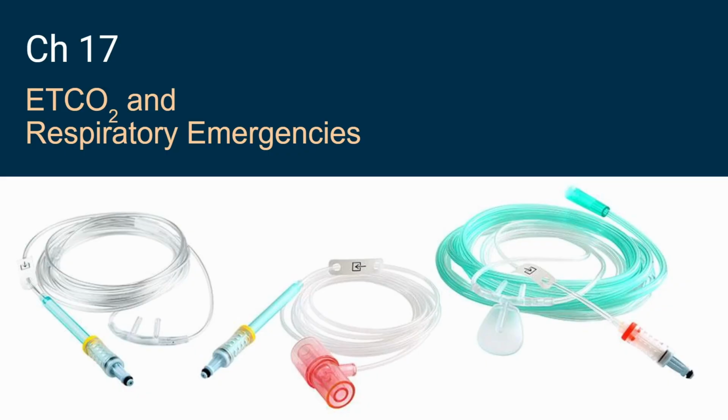I mean, this paddle on the right is designed to catch a breath and then channel that back up essentially to detect the CO2. There are even times where I'll have something without a paddle like this, and then I'll just put a non-rebreather mask over the top, right? To just kind of let that stuff collect. And as much as anybody would say, well, yeah, but isn't it collecting too much? I'm like, well, it's collecting at the same ratio that he expired it at, so it works. So if you're not getting an end tidal you like, just make sure that it's essentially working.